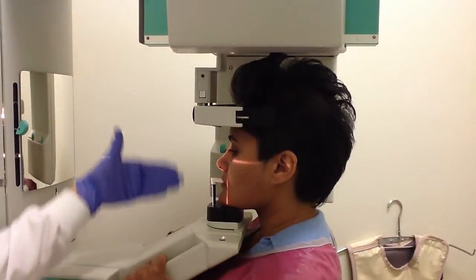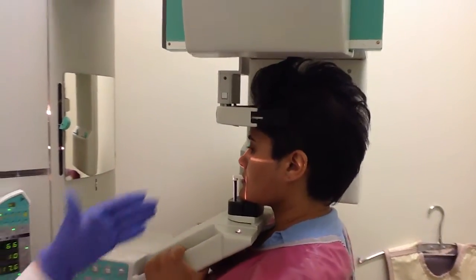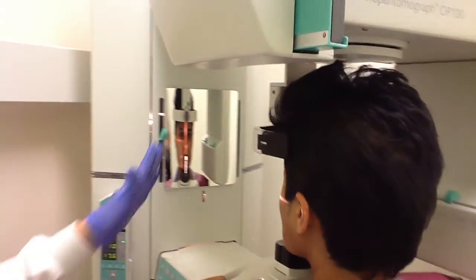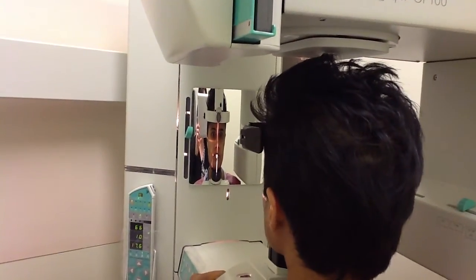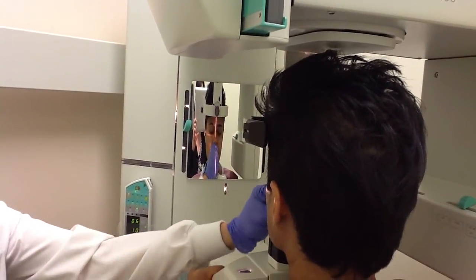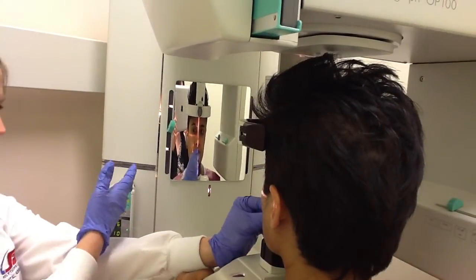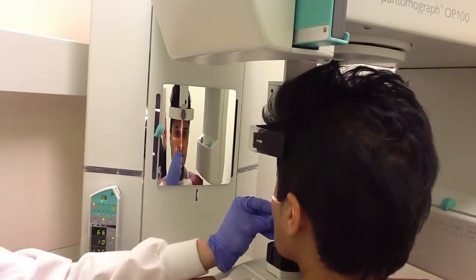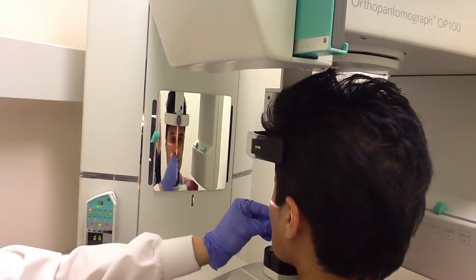The third line is the mid-sagittal light there. We're going to ask our patient to look into the mirror and ask them to position that line right through the center of their face. Okay, so if you can look in the mirror and try to line up that line in the middle of your face right through the center as evenly as possible. That looks good. Are you doing okay?